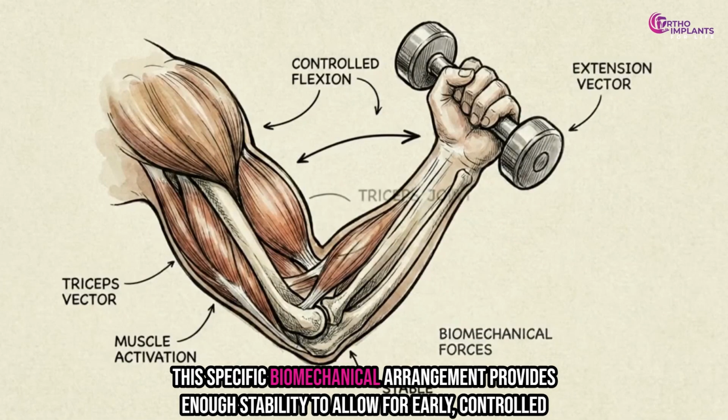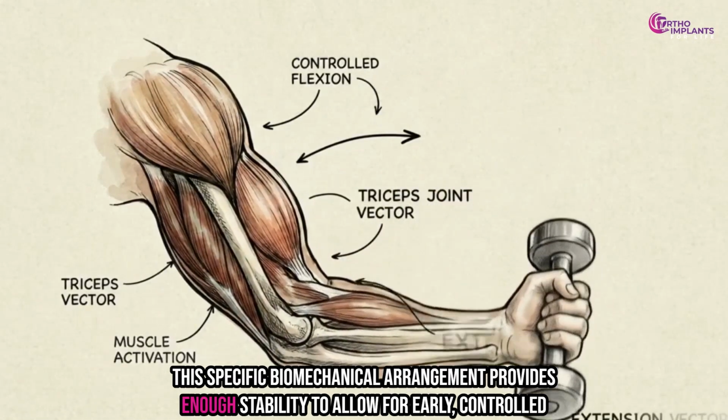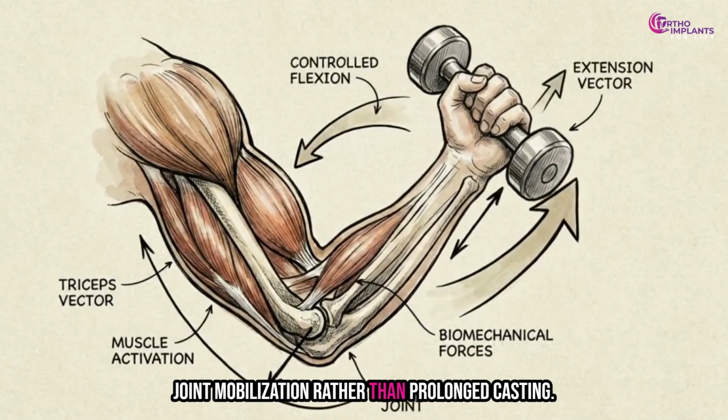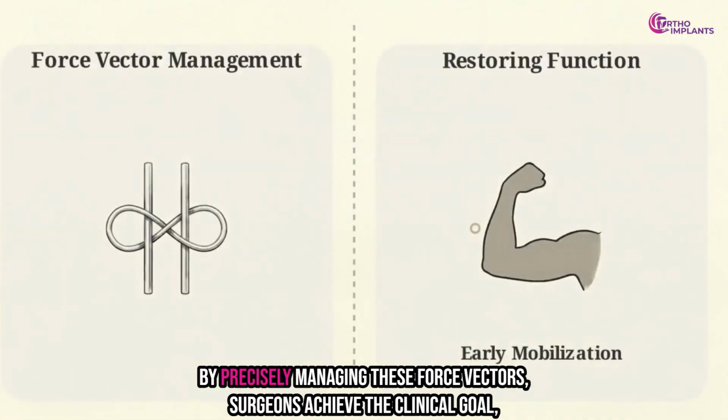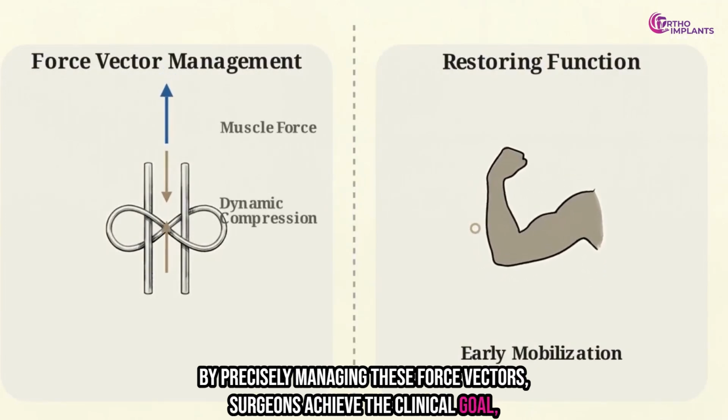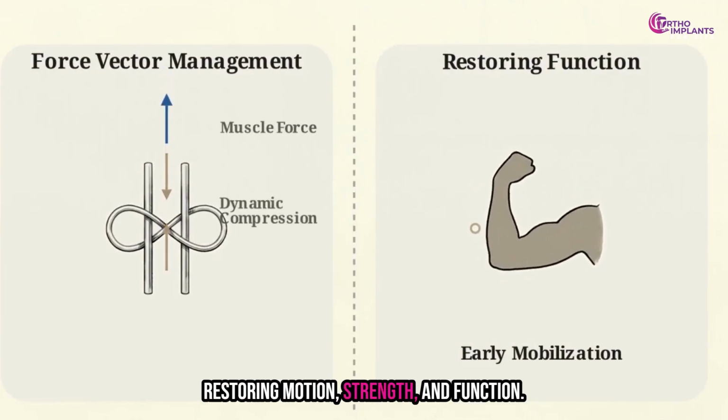This specific biomechanical arrangement provides enough stability to allow for early, controlled joint mobilization rather than prolonged casting. By precisely managing these force vectors, surgeons achieve the clinical goal, restoring motion, strength, and function.